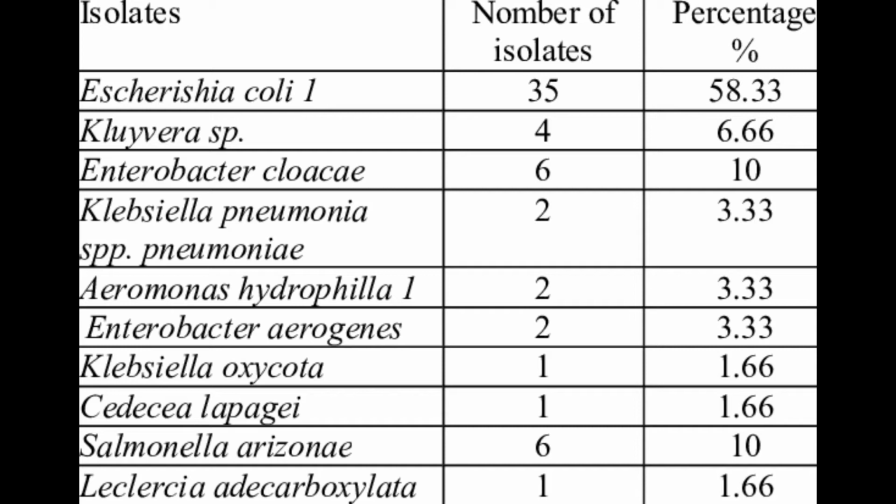They grow aerobically only in peptone. Let's talk about indole production. They use the enzyme tryptophanase. Their medium is tryptone broth, and their reagent is Kovacs reagent or Ehrlich's reagent. The positive is a red or purple ring on top of the medium, while the negative is a yellow ring.